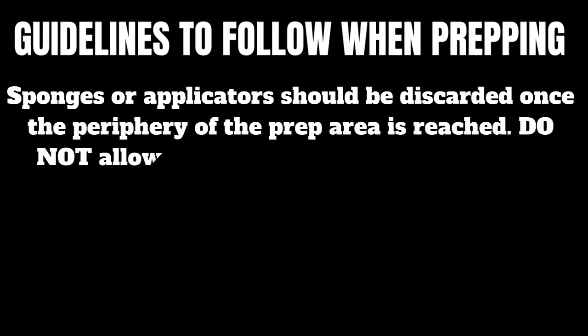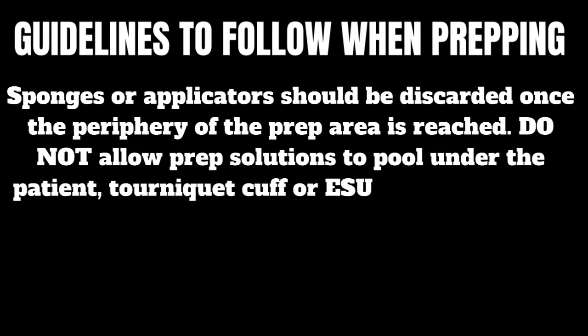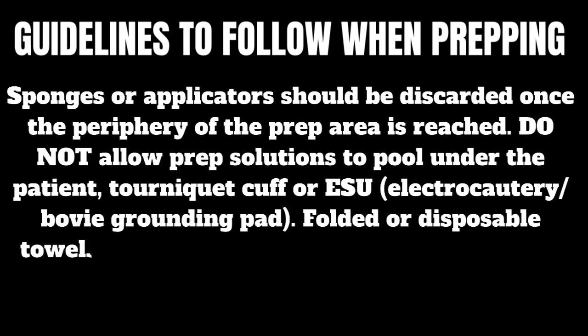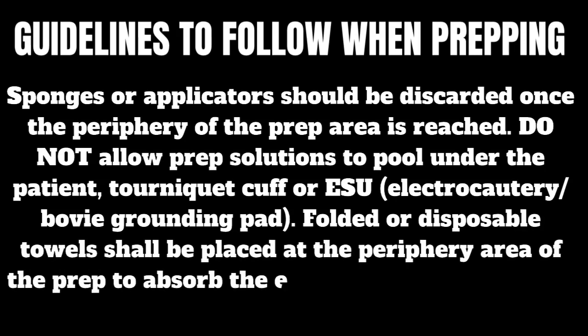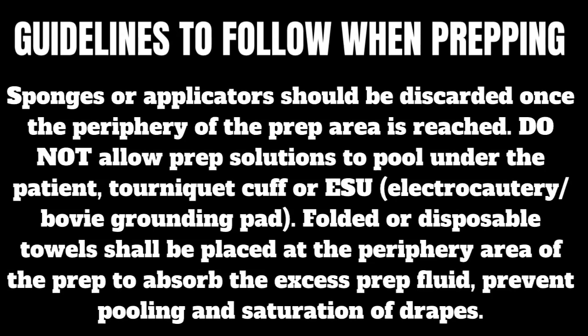Do not allow prep solutions to pool under the patient, tourniquet cuff, or ESU (electrocautery bovie) grounding pad. Folded or disposable towels shall be placed at the periphery area of the prep to absorb the excess prep fluid, prevent pooling and saturation of drapes.